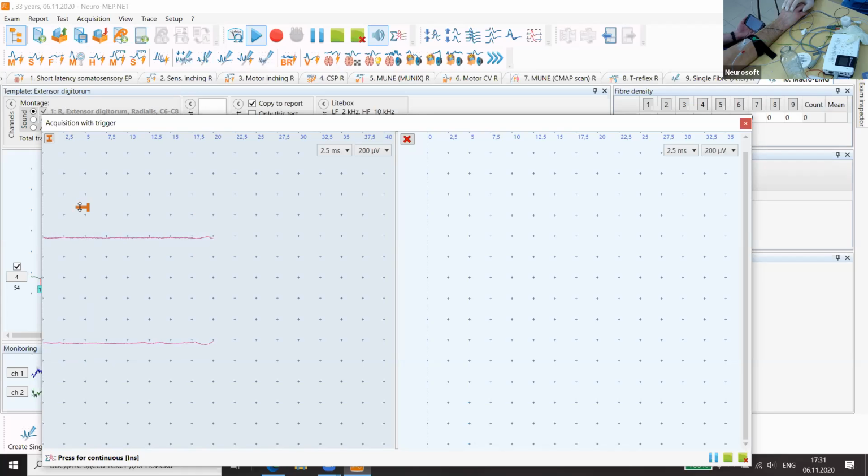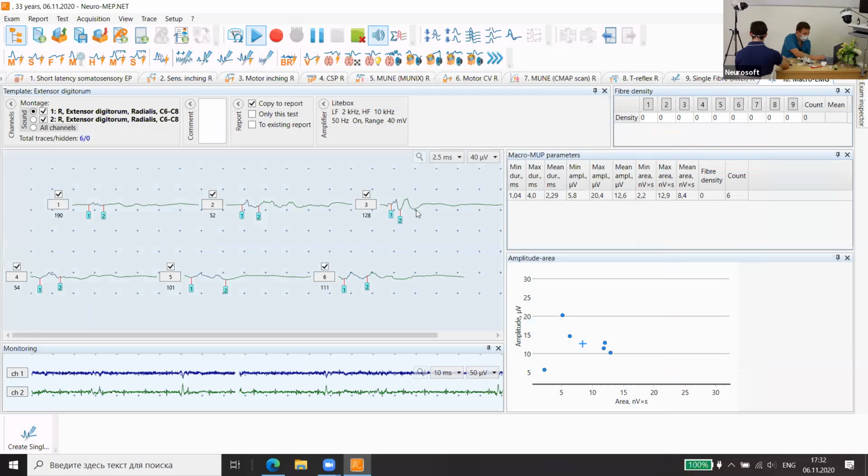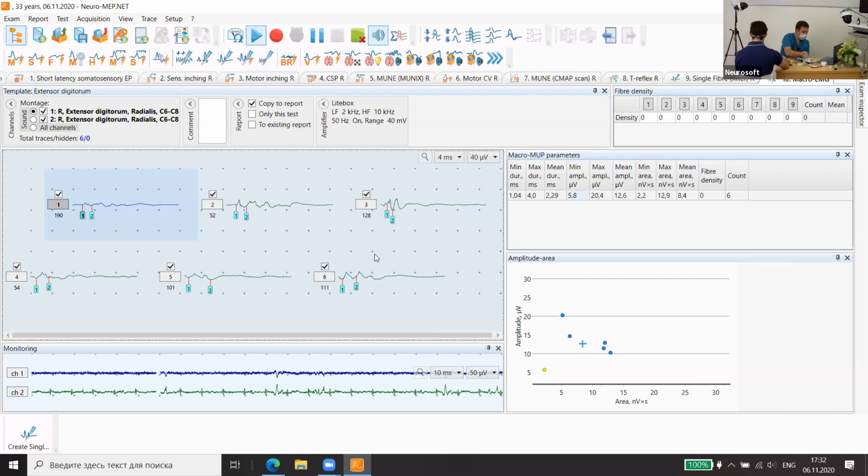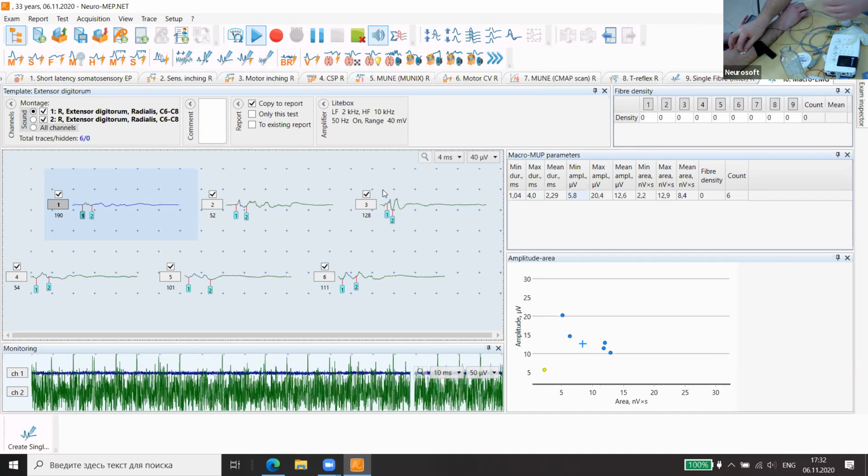Okay, in the same manner, we get up to 20 electrodes. Now we can see several nice ones, and some of them must be higher, but for example, we need to add up to 20 of them. So not ideal, but we will finish. Our patient is very tired. Thank you.